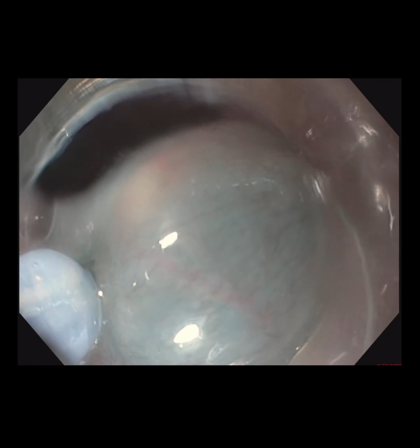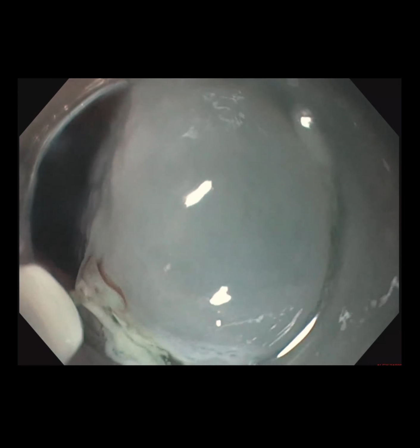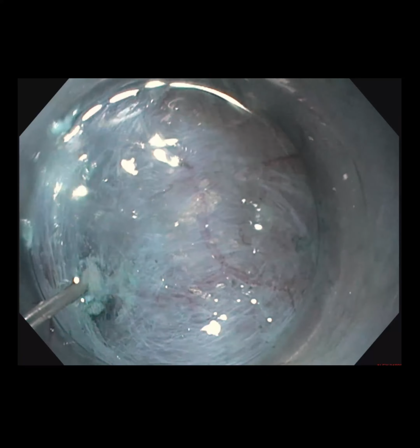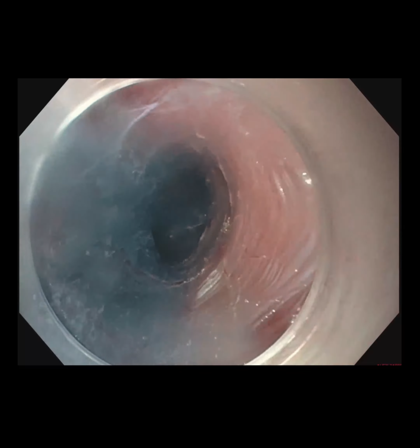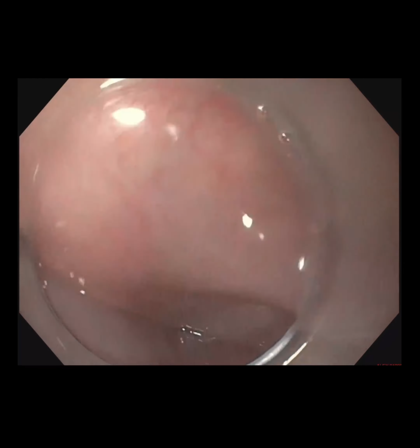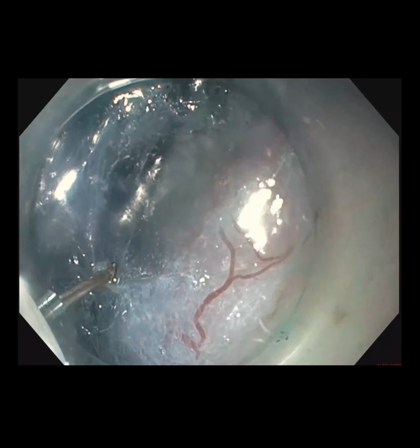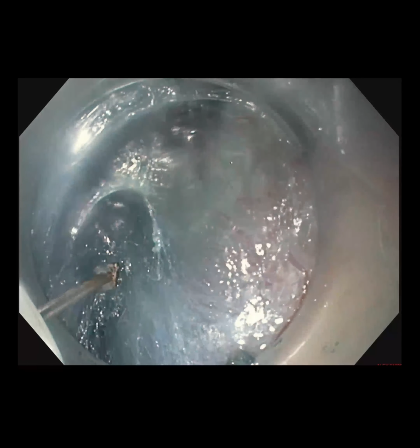The usual steps of POEM, that is submucosal injection, mucosal incision, and tunnel entry, were done. Careful dissection of the submucosal fibers, fiber by fiber. Intermittently, we visualize the orientation of the tunnel because of the sigmoid morphology. The submucosal dissection is continued.